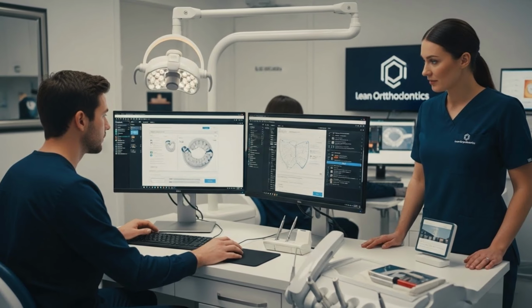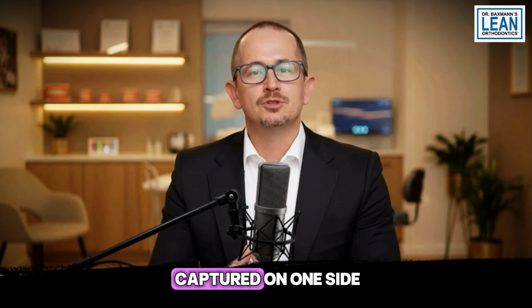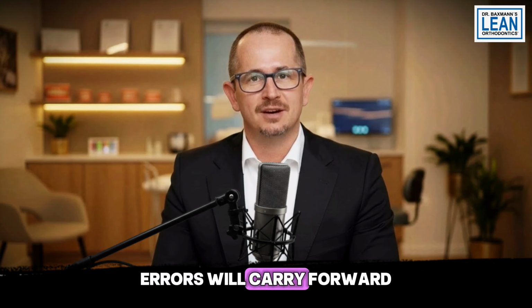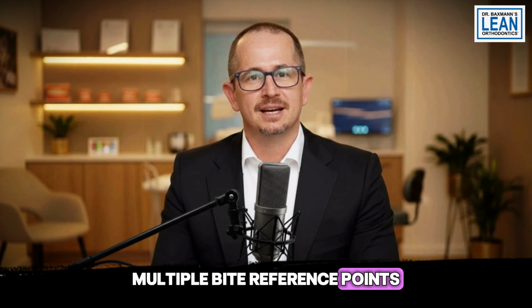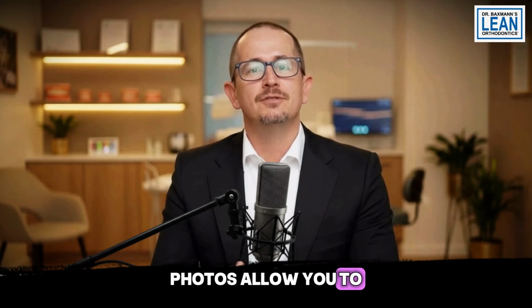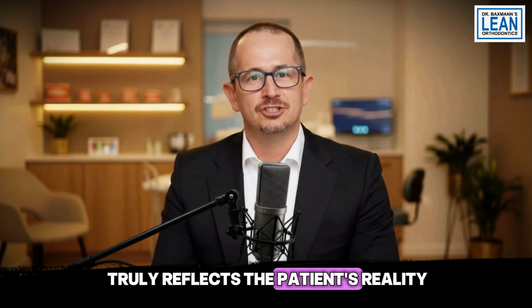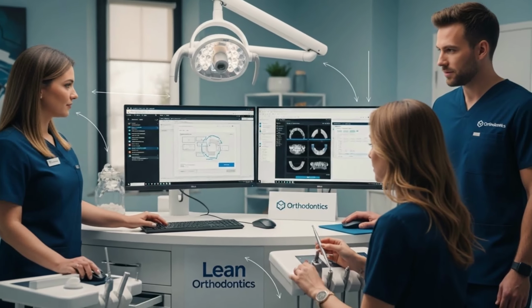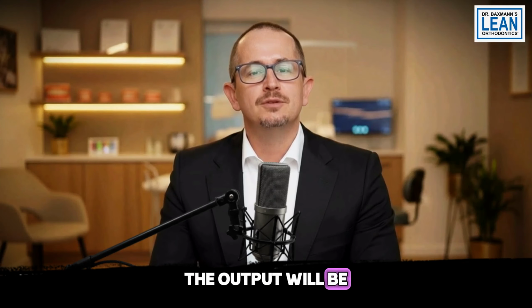A critical factor here is accuracy at the very beginning. Bite registration must be done correctly. If the bite is scanned poorly or only captured on one side, errors will carry forward into every next step. Multiple bite reference points combined with clinical photographs are essential. Photos allow you to verify midlines, symmetry, and jaw relationships so the virtual model truly reflects the patient's reality. The principle is simple. If the input is flawed, the output will be flawed as well.